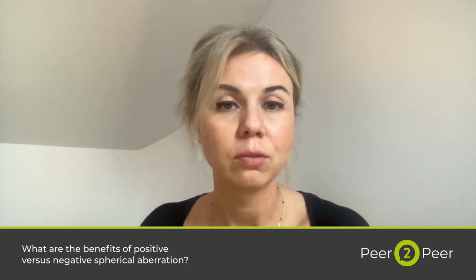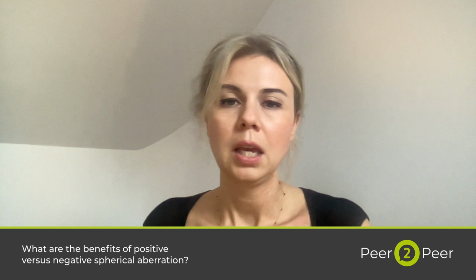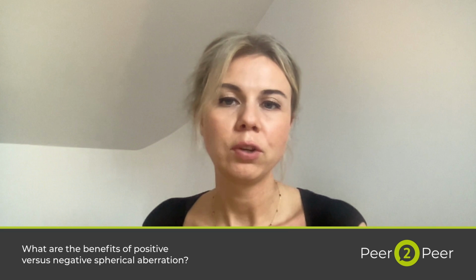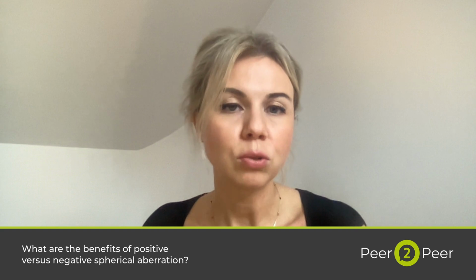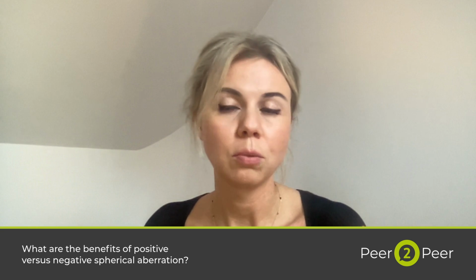Implanting an aspheric IOL with negative spherical aberration reduces the whole spherical aberration of the optical system and gives the patient perfectly sharp vision with no depth of focus and very small tolerance to ametropia. Implanting older types of spherical IOLs with positive spherical aberration can increase the amount of spherical aberration over the tolerated level and in the end decrease the contrast and cause dysphotopsias.